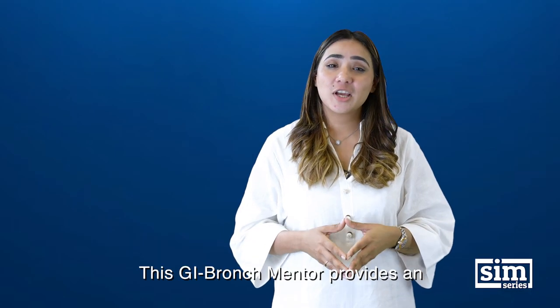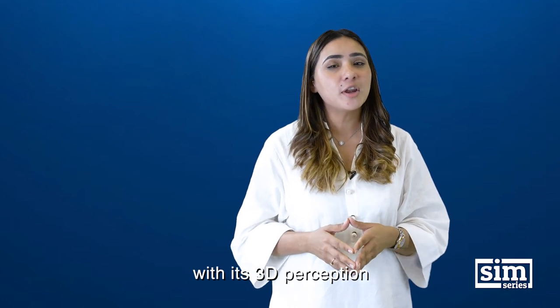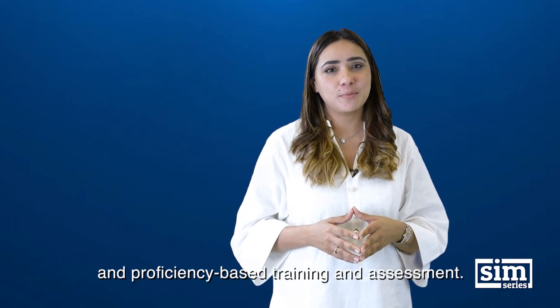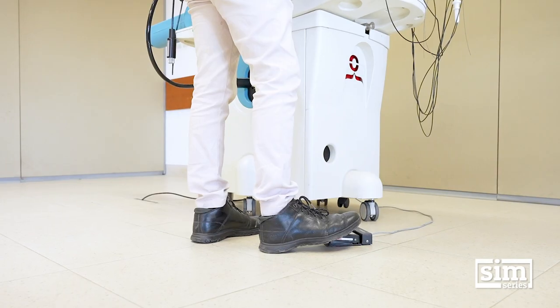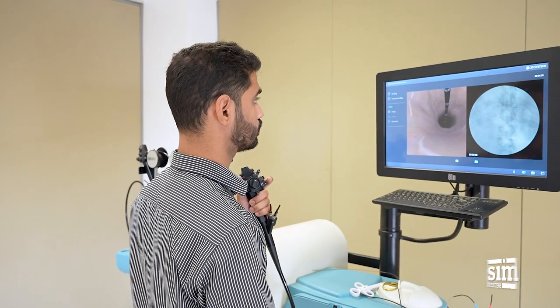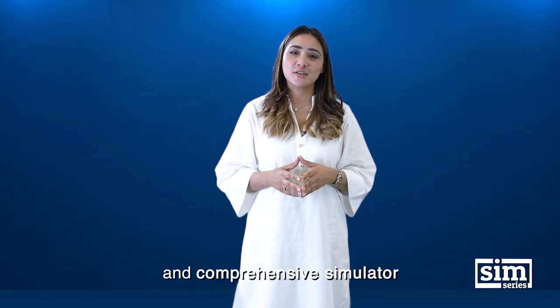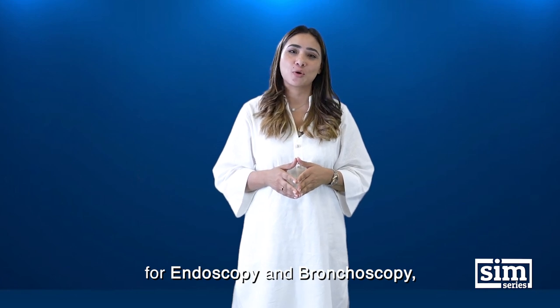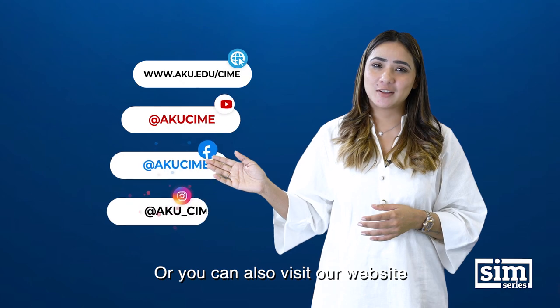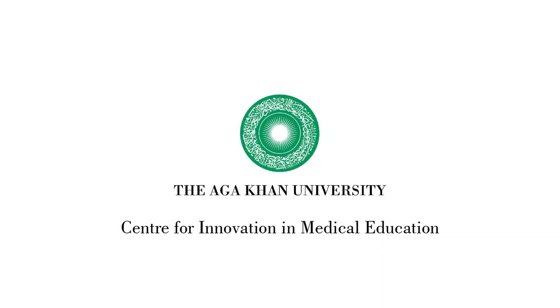This GI-Bronch Mentor provides an excellent environment for clinical procedures with its 3D perception and proficiency-based training and assessment. To explore this most realistic and comprehensive simulator for endoscopy and bronchoscopy, come visit CIME or you can visit our website for details of our simulators and more. Thank you.